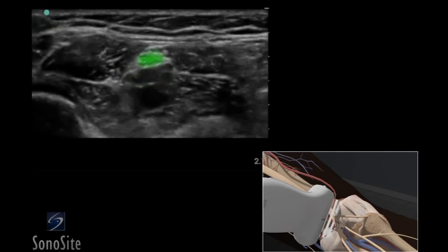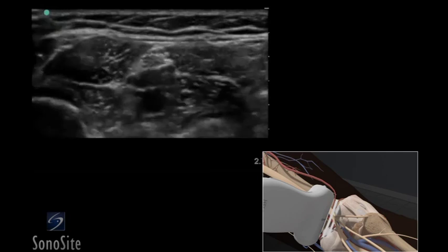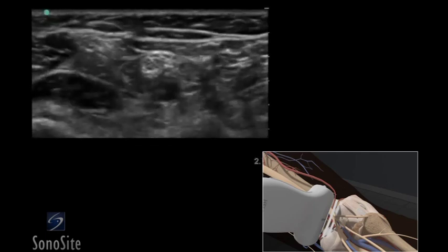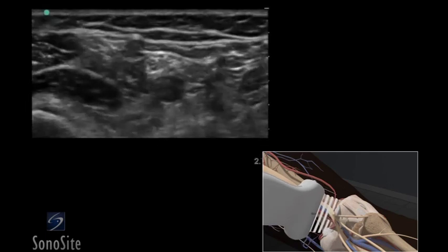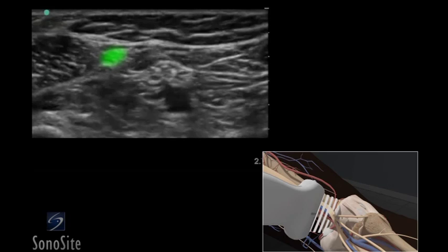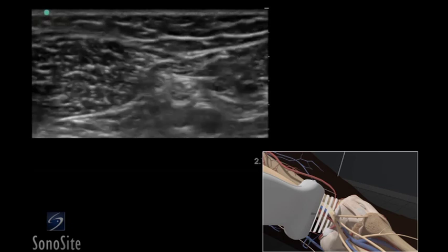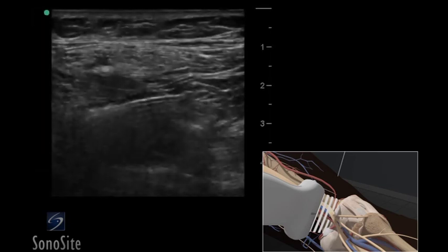The tibial nerve lies superficial to the popliteal vein and appears as a bright hyperechoic oval structure. The transducer should be slowly translated up the posterior thigh to identify the point where the peroneal and tibial nerves join. The ideal point for needle insertion is at or just below the split of the tibial and peroneal nerves.